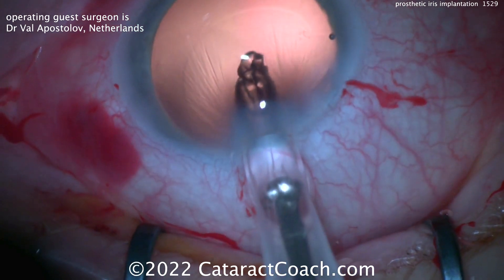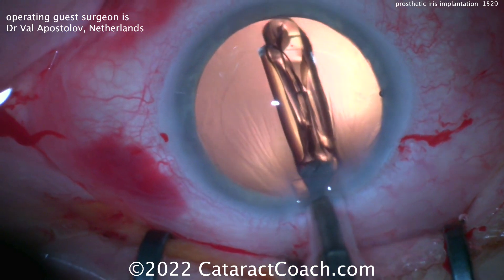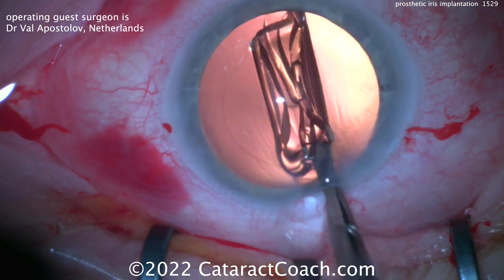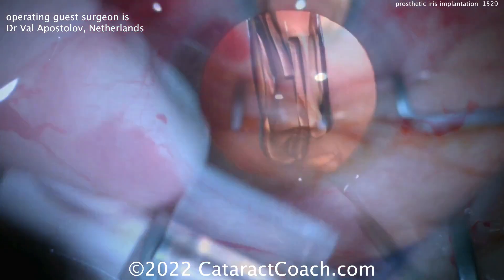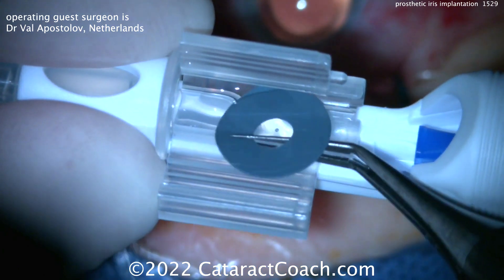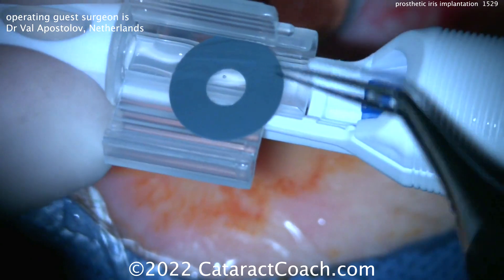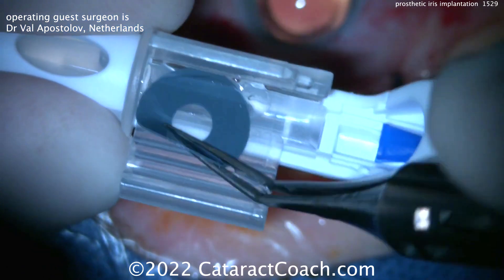Options for this are a few. Number one, you could do what we're doing here, which is a prosthetic iris device, which is going to go inside the capsular bag at the time of cataract surgery. You can also do some sort of suture closure if the iris tissue can sustain it and won't cheese-wire. You can also put in IOLs that have apertures in them — some lenses have a prosthetic iris effect built in.